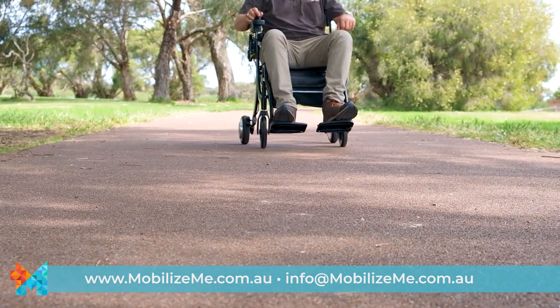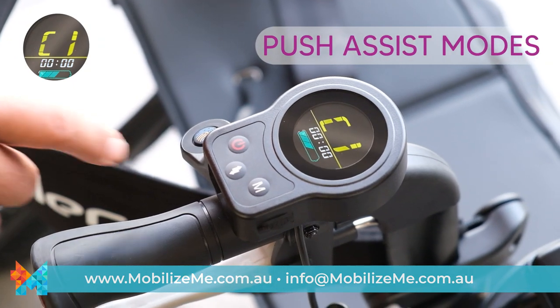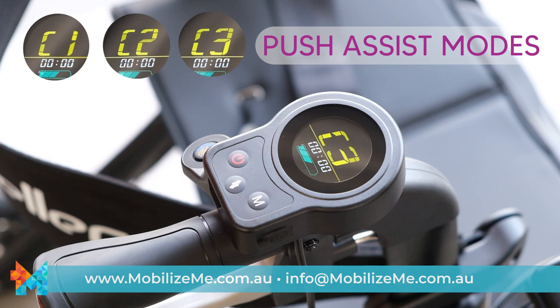The Evo is fitted with two controllers. At the back near the handles, you will find the attendant controller or push-assist controller. You can easily choose between different modes.